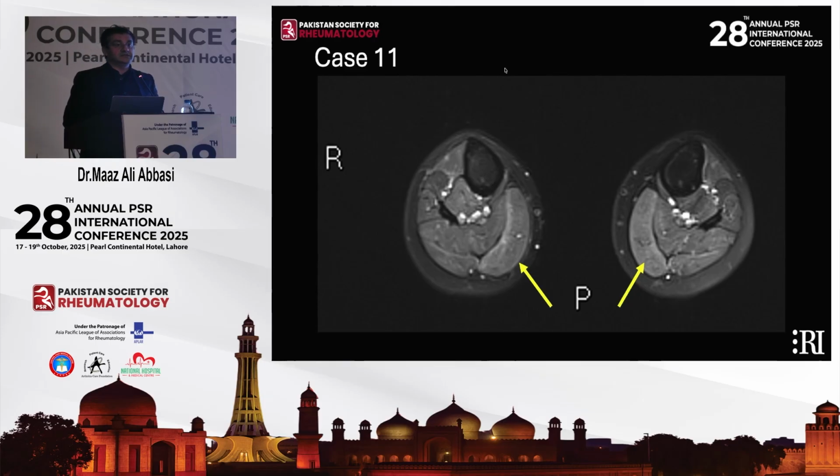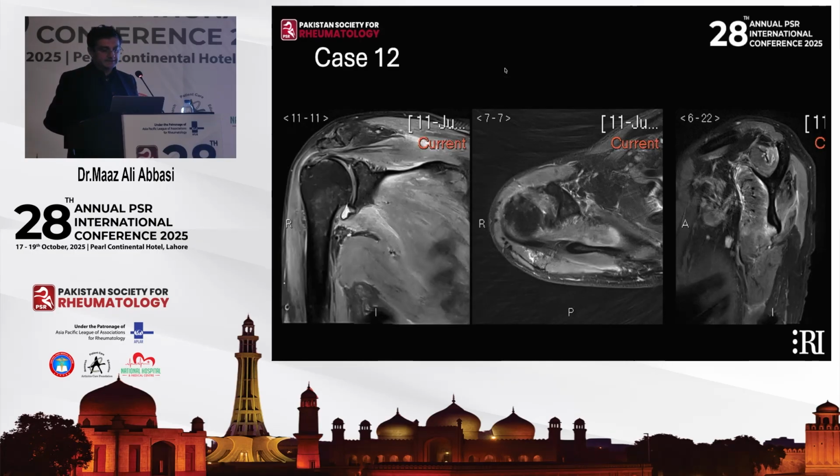So this is dermatomyositis. This is a myositis. And a myositis, therefore, dermatomyositis will present with a rash on the face. So that's what this is. For the people who thought it was a stress fracture, you normally see that on the medial surface of the tibia, which would be up here, not back here in the muscles. Okay, this is hard. A lot of radiologists would miss this.